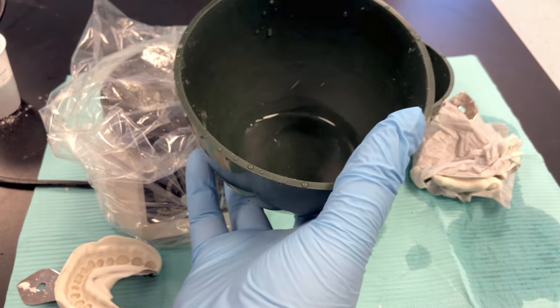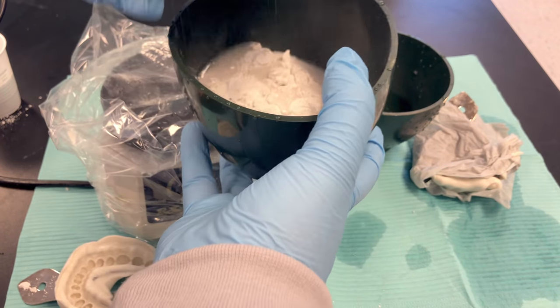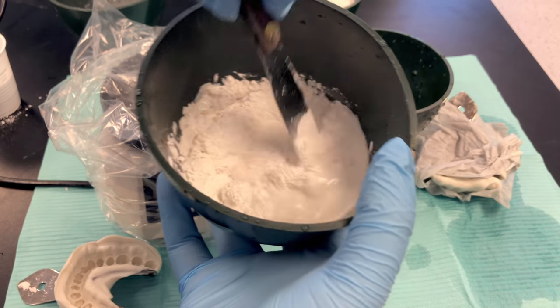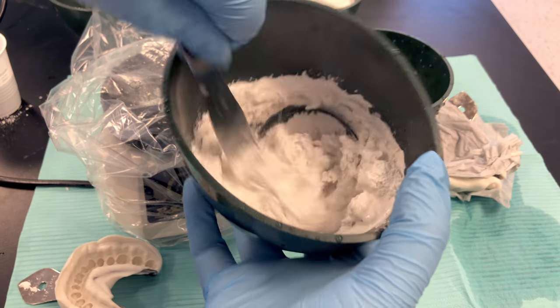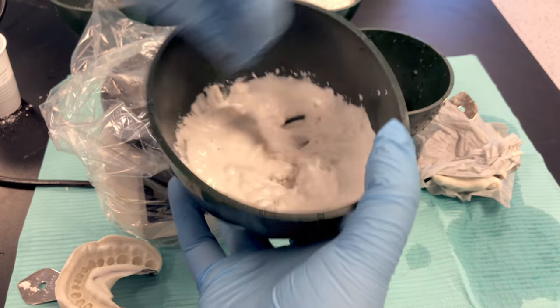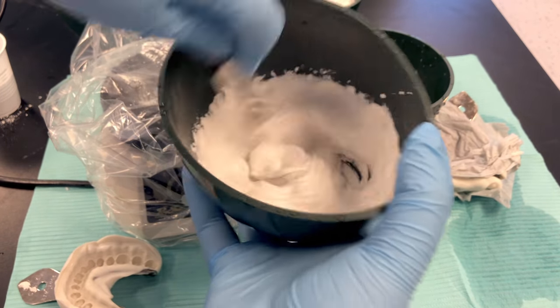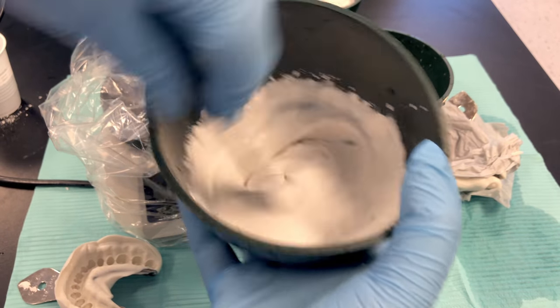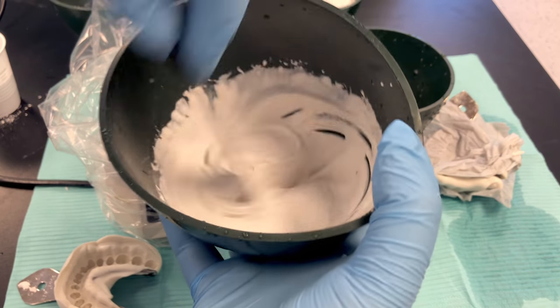When you mix, always add powder to water. Add it all at once. Take your plaster spatula and incorporate the powder into the liquid to get a nice smooth mixture. Don't mix any longer than 30 seconds because we have to get it onto the plaster vibrator to vibrate out all of the bubbles.